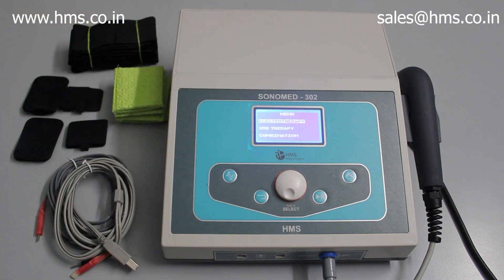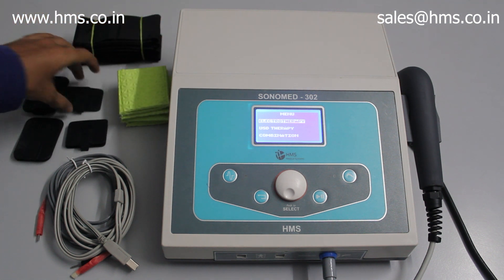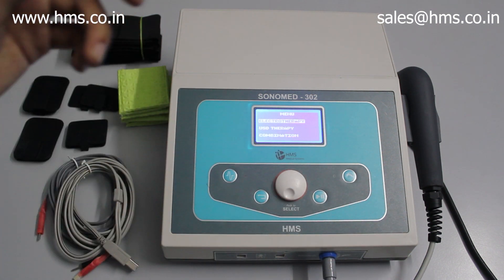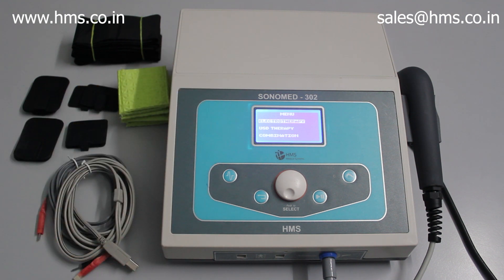Now let's look at the X series which comes along with the 302. You'll have four straps, two pairs of pouches, two pairs of small electrodes, two pairs of big electrodes, two cables, a transducer, and the mains cable. These are the X series accessories included when you purchase the 302.